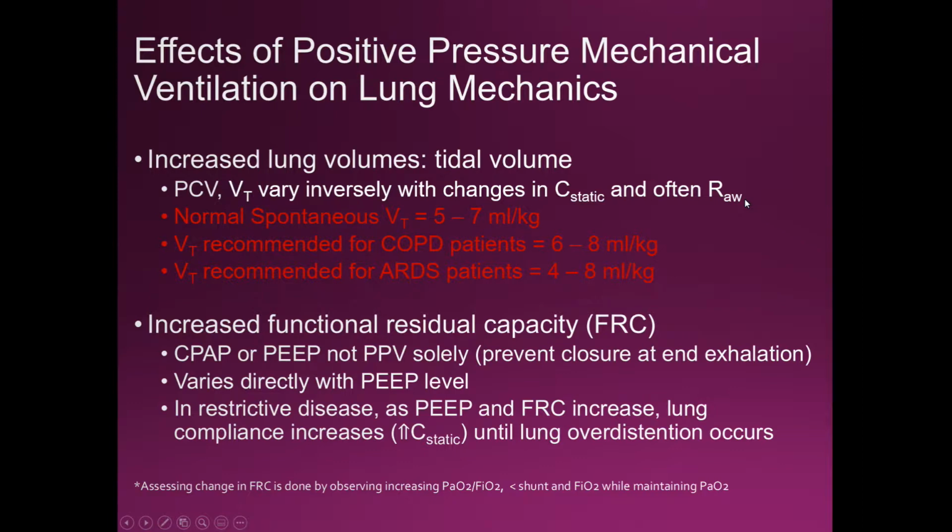Okay, so here's another way to take a look at it. If I'm on volume control and I start to inflate the lungs, okay, at beginning of inspiration, my pressure, there's a little bit of pressure in the lungs, but not so much.